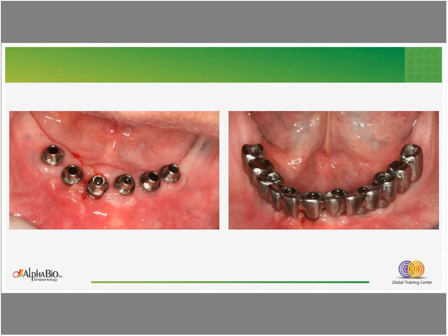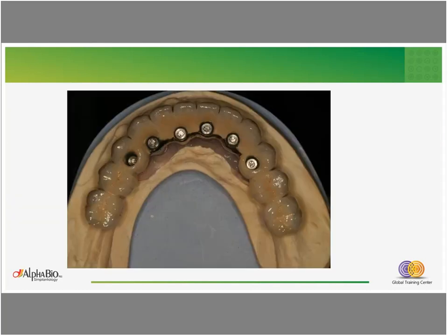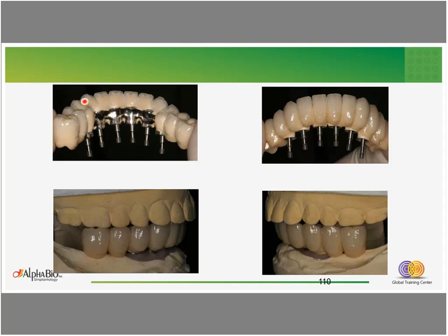This can also be achieved easily. There's no problem with angulation, and there's no excessive cement, so that we can manage the soft tissue much more easily. This is the final restoration. The opening of the screws is plugged with composite. And this is the final restoration.